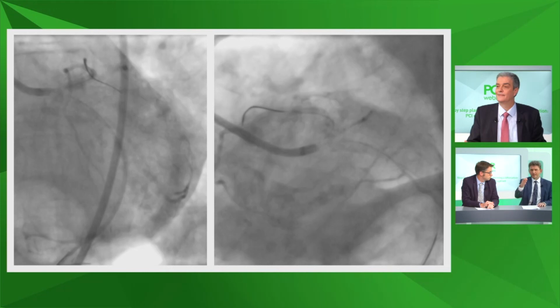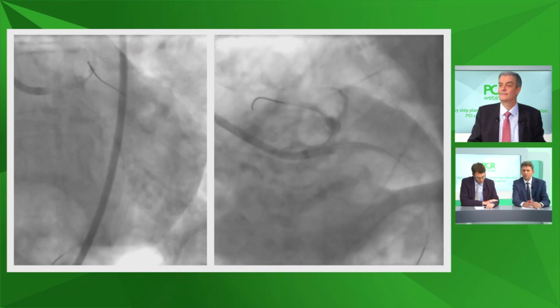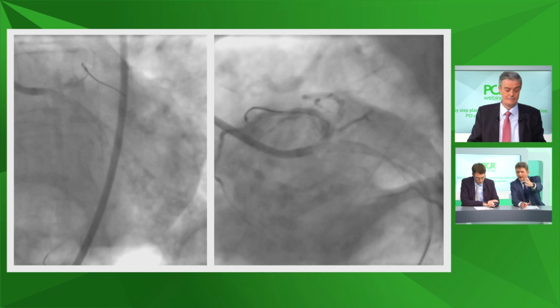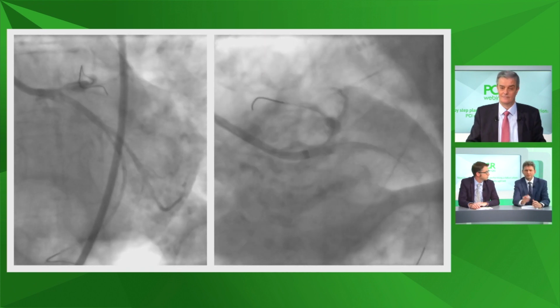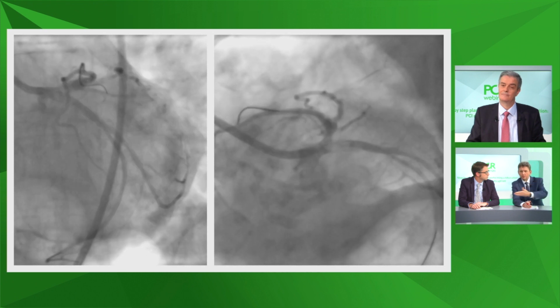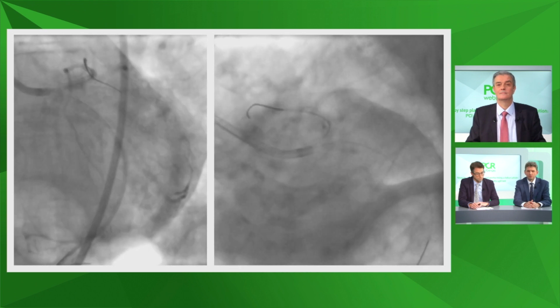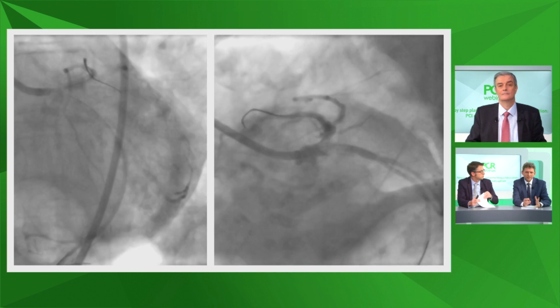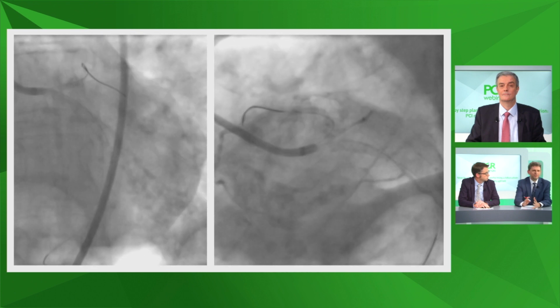So, Maciej, where are we now? Yeah, what I see now, the vessel is open, so now we know that what we see, this haziness, is not a thrombus, but it's mainly calcium. So I'm really satisfied with this guide, 7 or 8 French, even 8 French, because now I know, just having seen this awful calcium in the circ, that I will have to use rotational atherectomy, and it may be that I will have to use a burr bigger than 1.5 or 1.75.